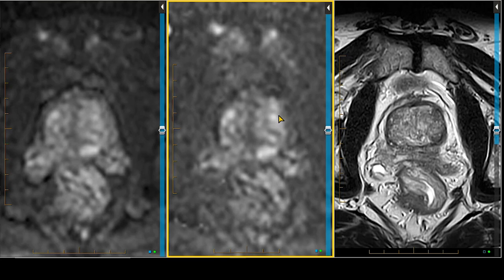So why do we have both? The 2D T2 is used to match the scrolling function, and T2 axial imaging also gives you better contrast resolution than 3D thin-section imaging. You might ask: if 2D has better contrast resolution, why also acquire a 3D axial T2? The answer is simple — you need it to do mapping and volumetric analysis of tumors for correlation with intraoperative ultrasound and MRI.